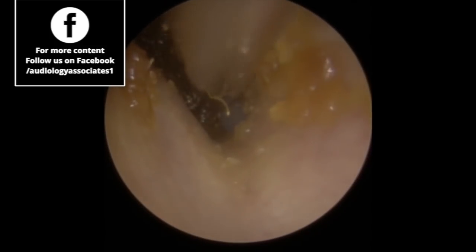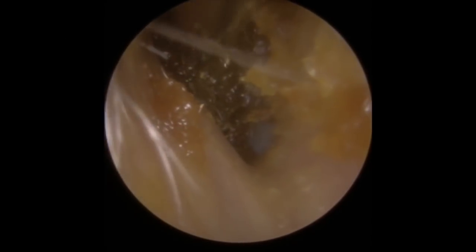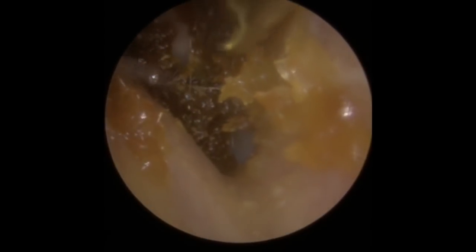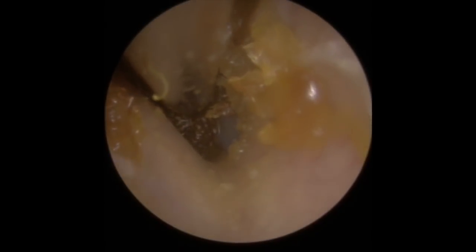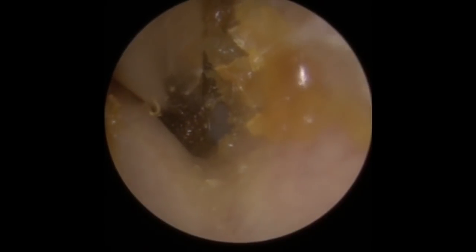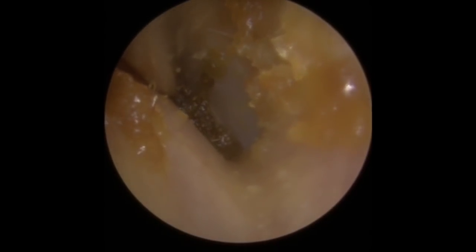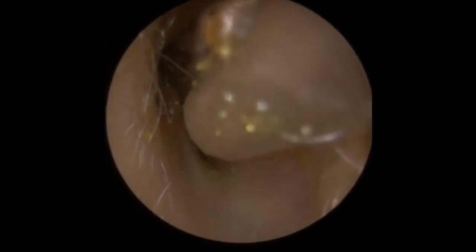Still undercutting this wax at the moment. Now we can just start to see the eardrum — that little blue circle you can see is the eardrum. We know the kind of depth we're working with now as far as this wax is concerned. Now we've undercut that, we can start pulling down from the top and we can see little gaps. I can see as we're suctioning this that the left hand side of the wax is tucked behind a little bump in the canal, which is going to prove a little bit more awkward to remove.